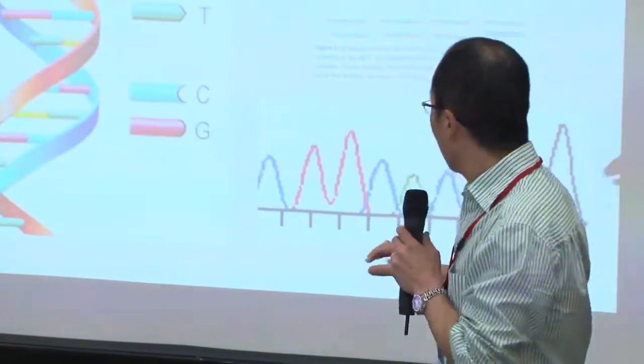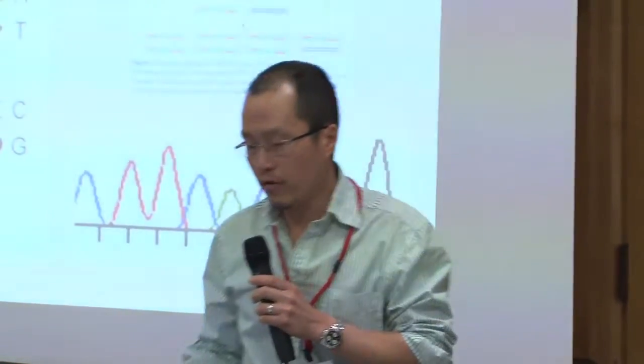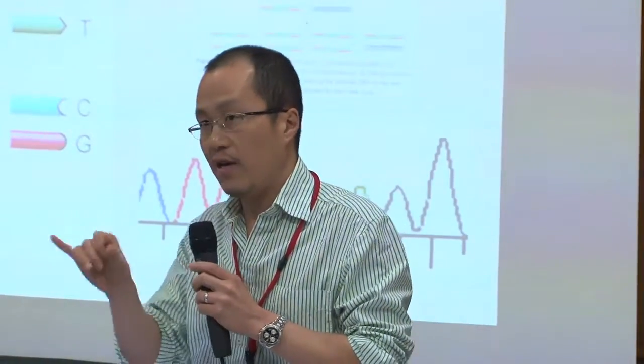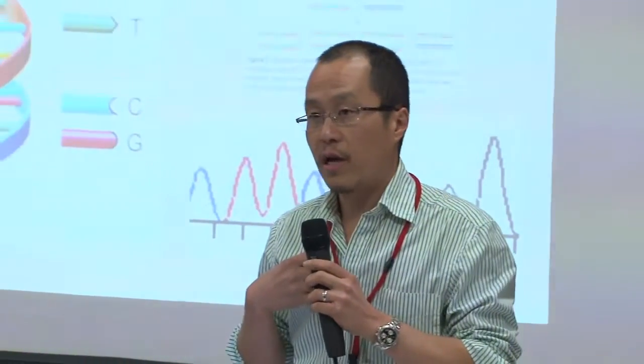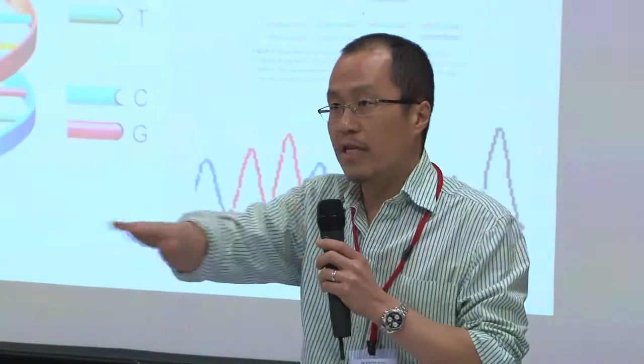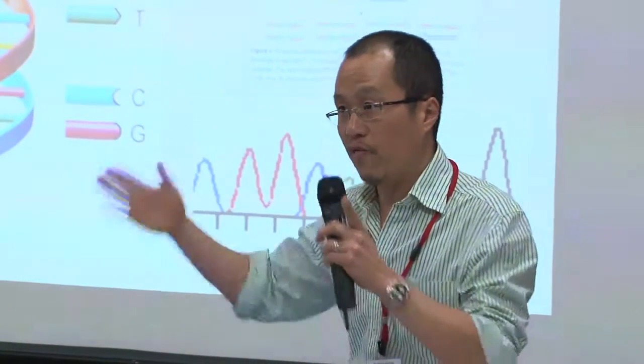And we use a technique called PCR, which you may or may not have heard of, which stands for polymerase chain reaction. And what it does, as I said, it amplifies so many copies of the area that we are interested in that we can then slip that through a special machine called a sequencer, and that will give us a readout of the different nucleotides in that amplified bit.